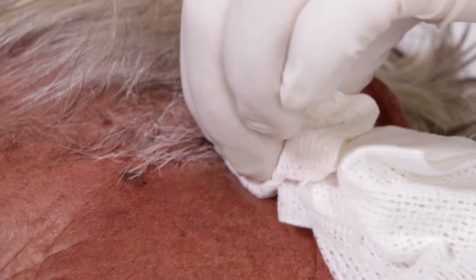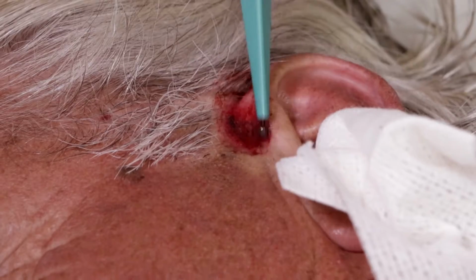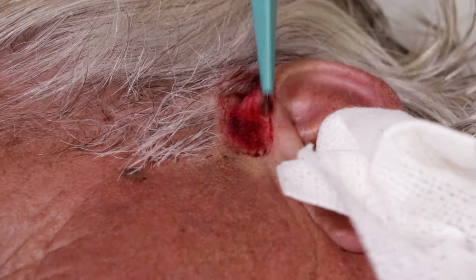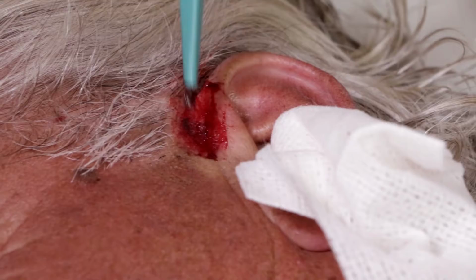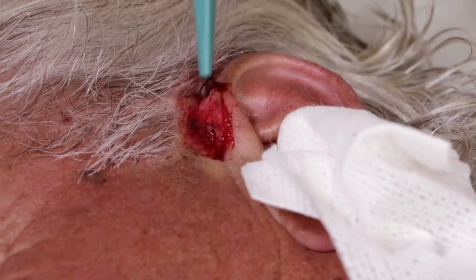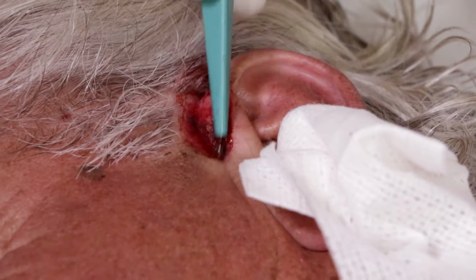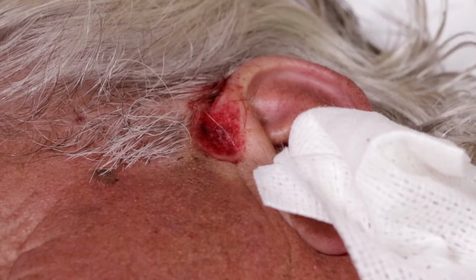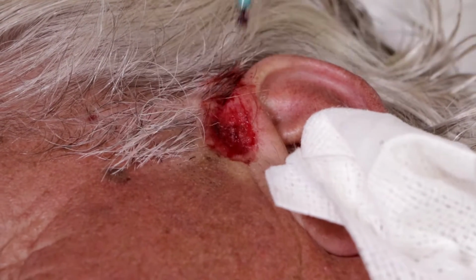All right, let's get that. Pushing really hard on you here. And yeah, you can feel it there. It's about the size of a pencil eraser kind of area. Oh, it's even smaller than that. It's just 3 millimeters, very small. That's why I have to do it a bunch to get the whole area, because it is rather small.